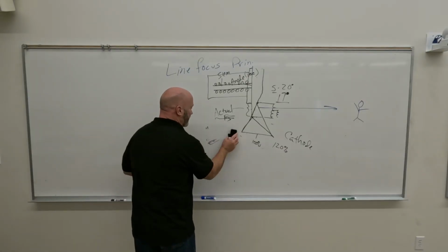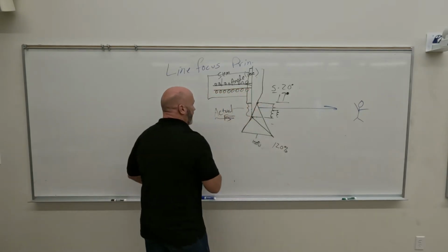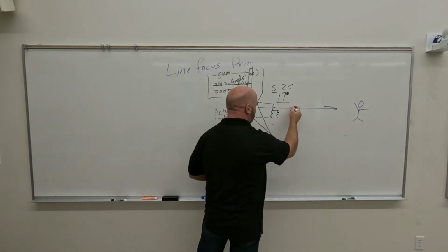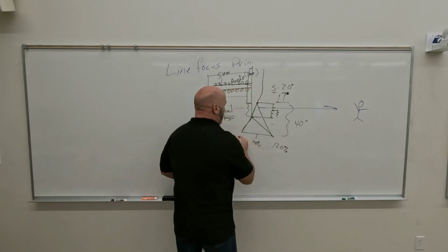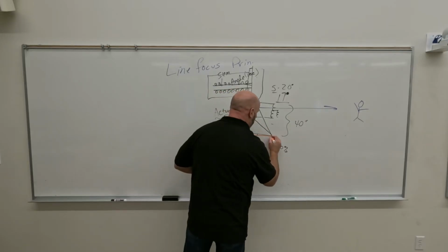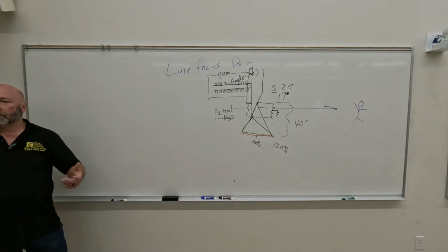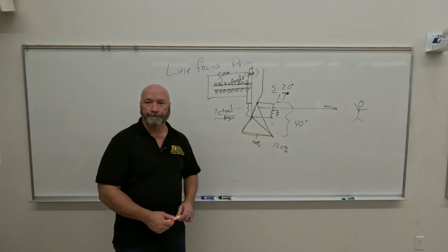Say we shot this particular image at, just bear with me, I know this is not to scale, but let's say this is 40 inches. And we wanted to cover an image receptor that is this big. Okay? So maybe an AP L spine.